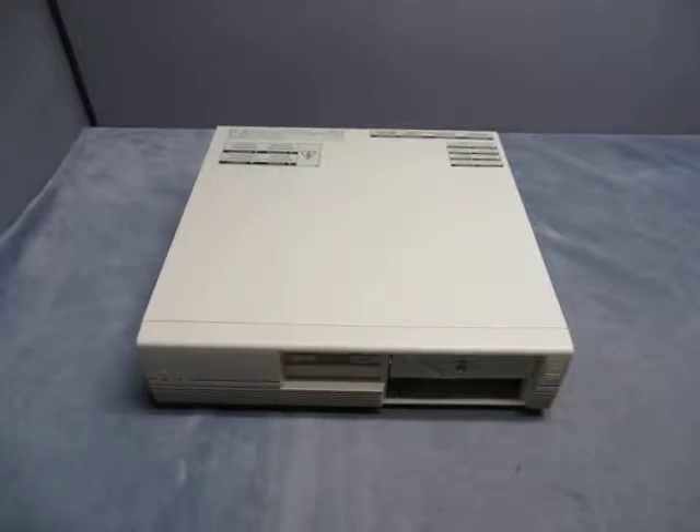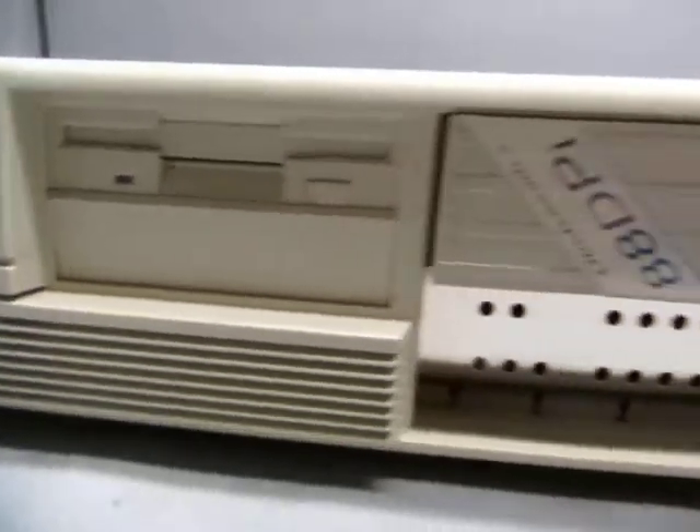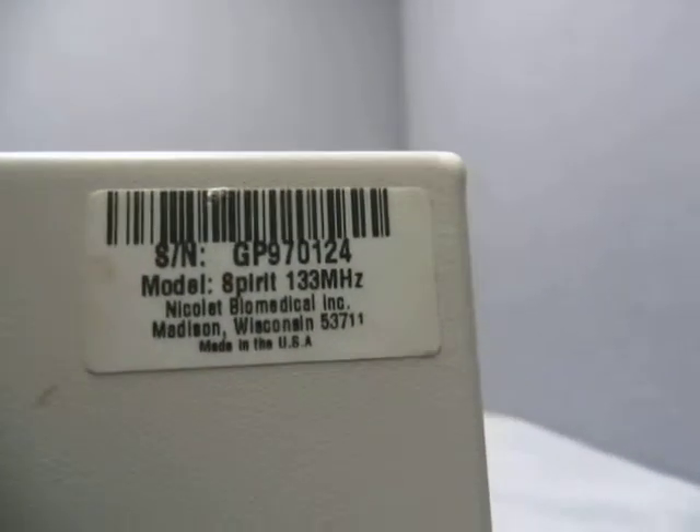For sale we have an Auto Dynamics 88 DPI machine. I'm not sure what it is, but let's give you a quick tour. You've got a floppy drive, it's an OAE ILO system — the probe goes in there. Power button — here we go. It's a Spirit 133 megahertz, Nicolette Biomedical.